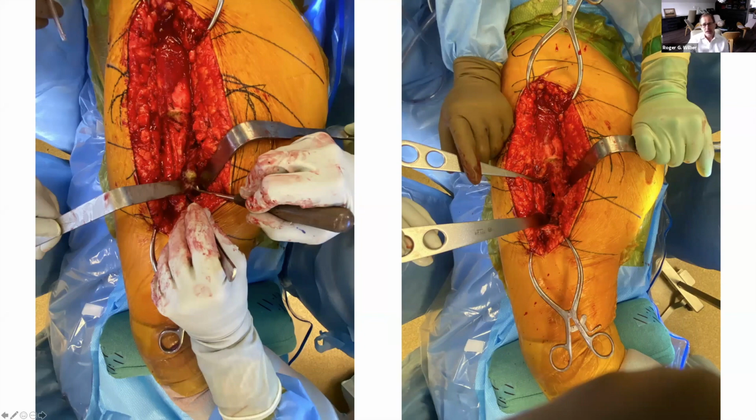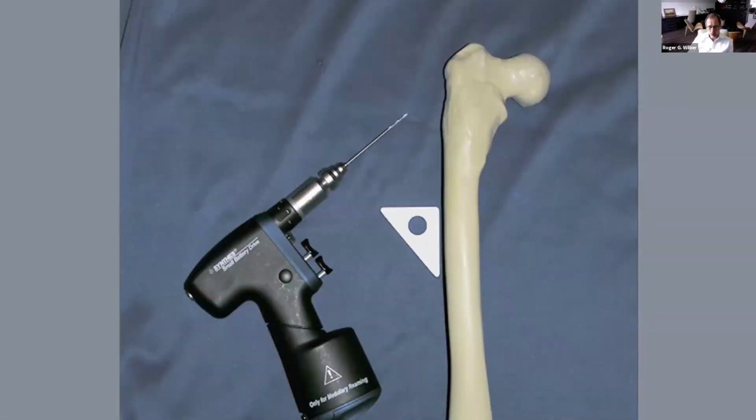And then what you're looking at here is the proximal femur, the lateral border of the femur. You can see that the vastus has been taken off the vastus ridge very cleanly. You're not dissecting over the anterior or posterior aspect of the femur, and you don't need to clean off the trochanteric region at all. So very nice dissection.